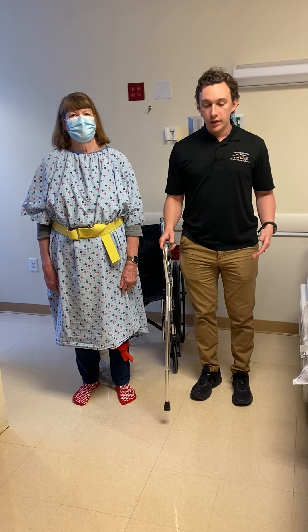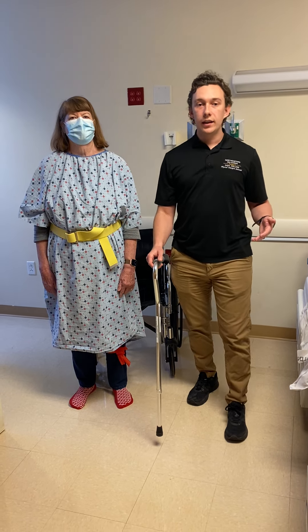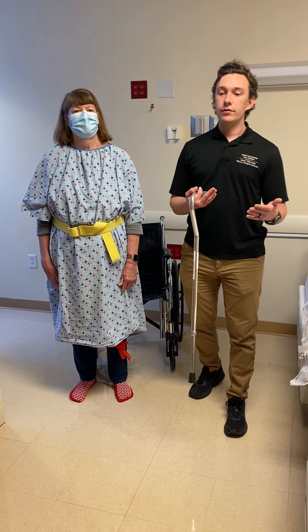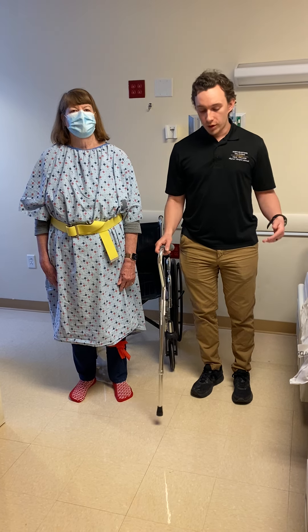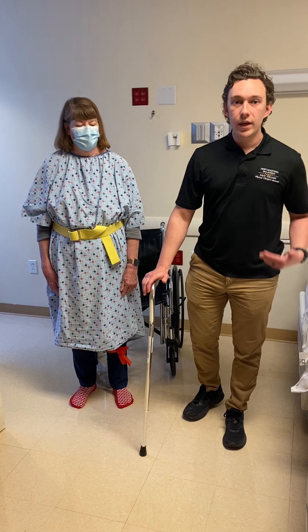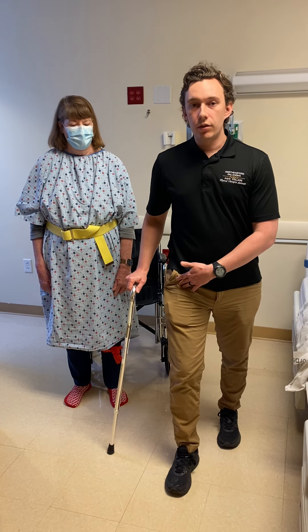Now when the patient is walking, following the same principle as with a walker, typically you have the assistive device, then the bad leg, and then the good leg. We're going to follow that same sequence. As the patient gets more fluid, they can start fusing some of those principles together. With the assistive device going with that same bad left leg, that allows for a wide base of support when the patient is on their bad lower extremity, while this cane allows balance as they sequence through their good leg.